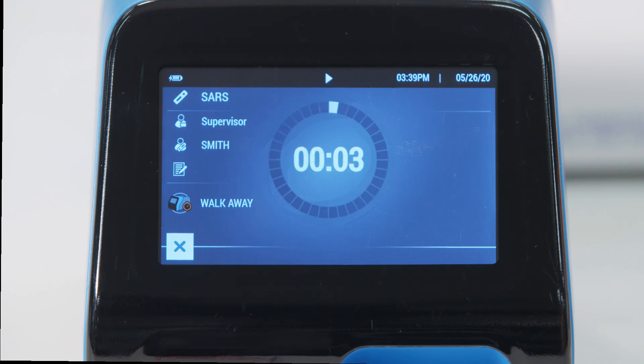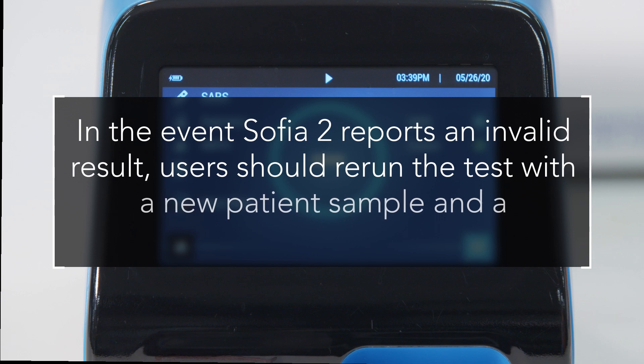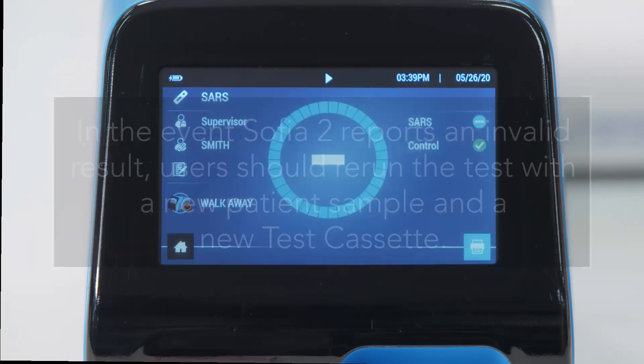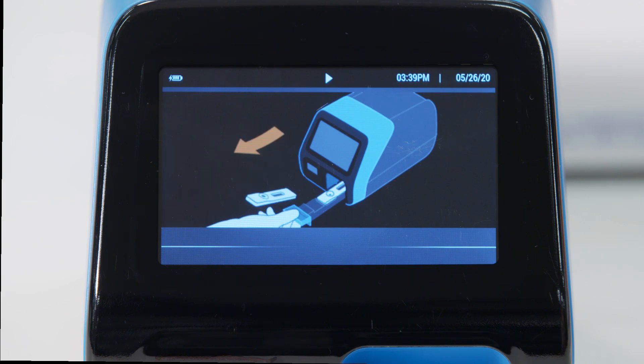When the test is complete, the results screen appears and informs the user if the test was positive, negative, or invalid. In the event SOFIA2 reports an invalid result, users should rerun the test with a new patient sample and a new test cassette. Press home and follow the on-screen directions, then return to the run test screen.